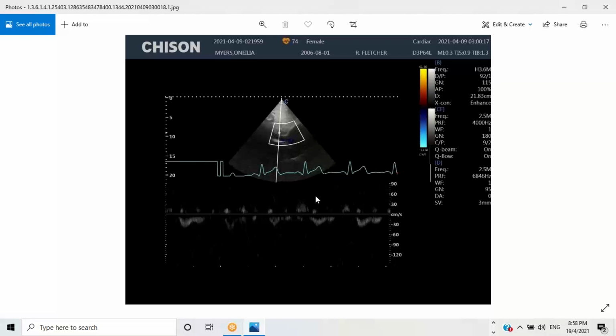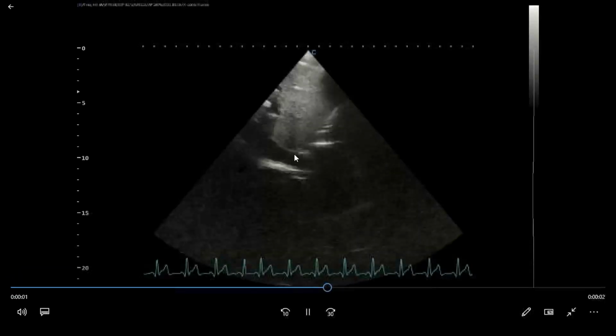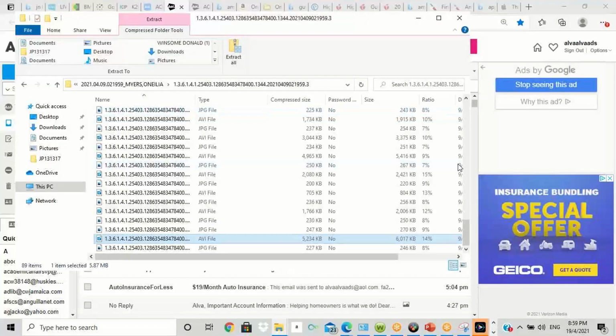Identifying the hepatic vein flow and the different components is crucial. So you need to understand this. This is your first look at Doppler incorporated into the regular echo studies. We're going to have to go over a few more, looking at some pathology, such as significant regurgitation and stuff like that. So you'll have a much better understanding of the Doppler.